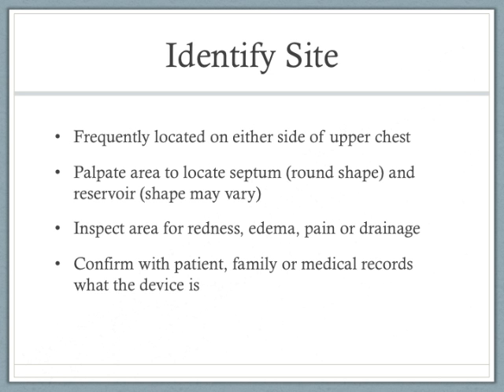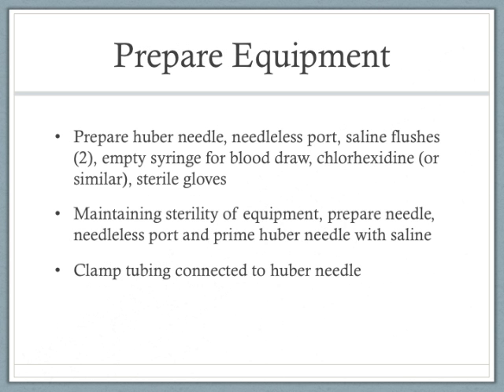Every time you go to access one of these, you should inspect the area for redness, edema, pain, or drainage because those can be signs and symptoms of a problem with the port and may make the port non-usable at the time. You should also confirm with the patient, family, or medical records what the device is prior to accessing it and administering IV medications or fluids.